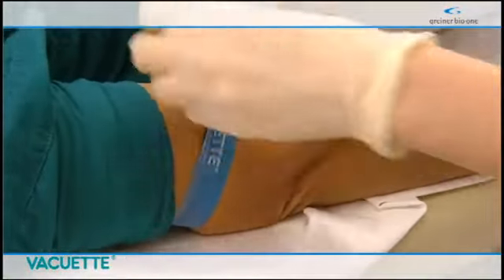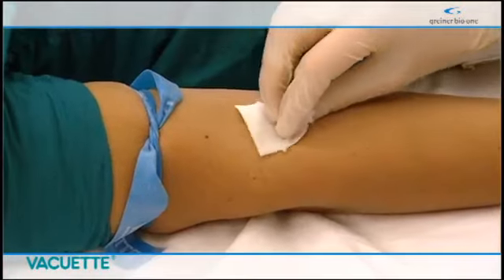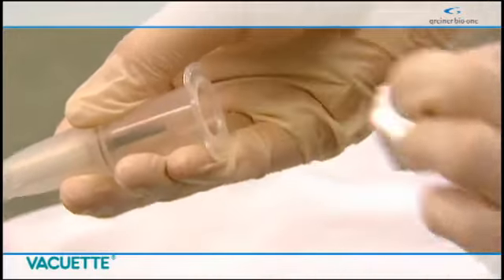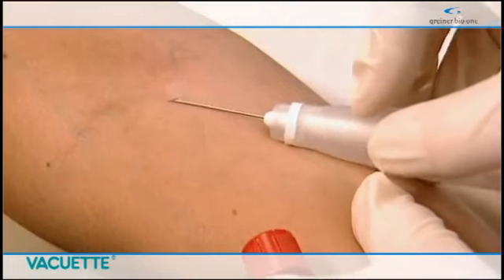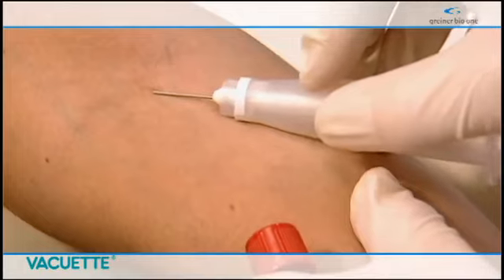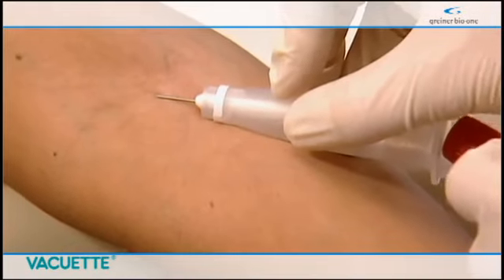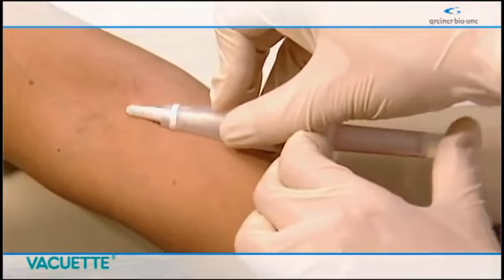Apply the disposable tourniquet, disinfect the puncture site using a circular motion inside to out. Remove the protective foil at the rear of the holder, then the plastic needle cover. Insert the needle into the vein as usual, then insert the tube into the holder.